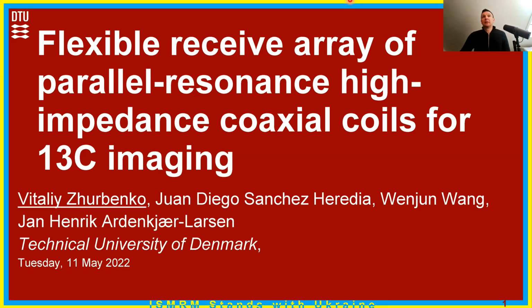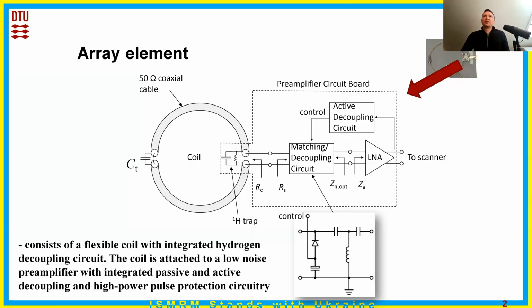Hello, my name is Vitaly, and the topic of this video is how to design a flexible receive array of parallel resonance high-impedance coaxial coils for imaging of carbon-13. MRI coils are typically operated either in an inductive or a self-resonant mode.